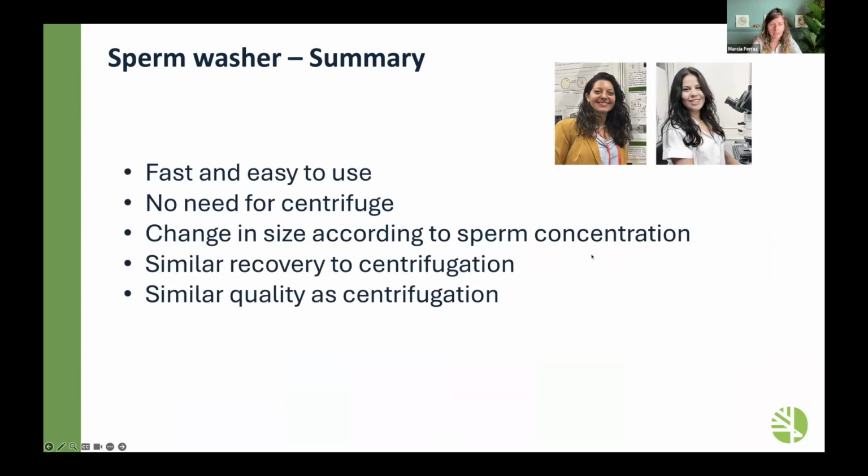So we were pretty happy with this device because it was fast and easy to use. Instead of having to centrifuge your semen for 5 or 10 minutes, depending on the species, you can wash it in a minute and resuspend it with the media you want. You don't need centrifugation. We do need to change the size according to sperm concentration, and we've been working on having different sizes to see the range of concentrations that are good. We have similar recovery and similar quality as centrifugation, which is really nice because that gives us an opportunity to use this in the field or in the clinic without having to centrifuge the sperm.